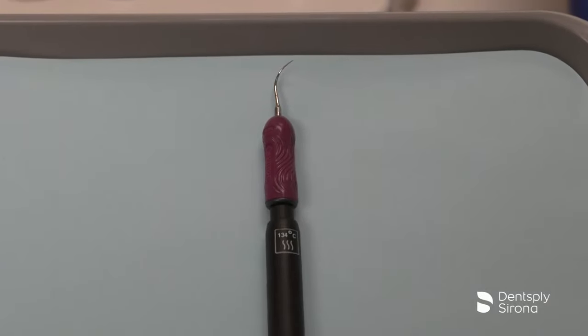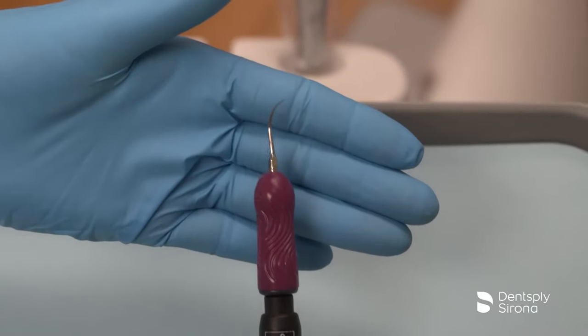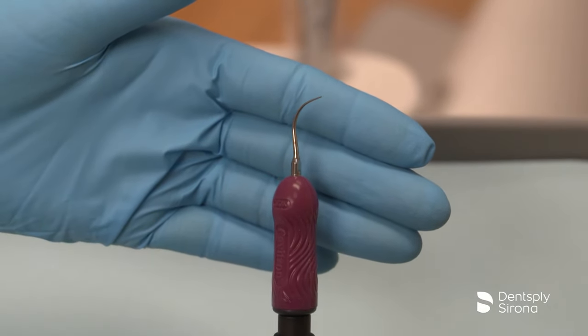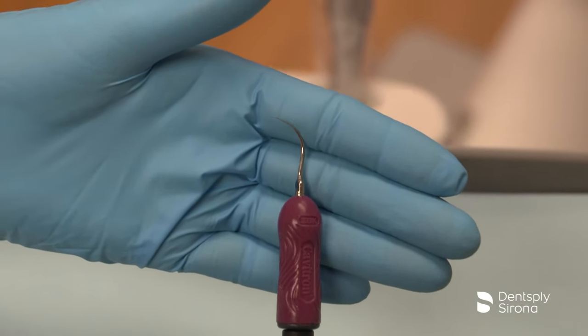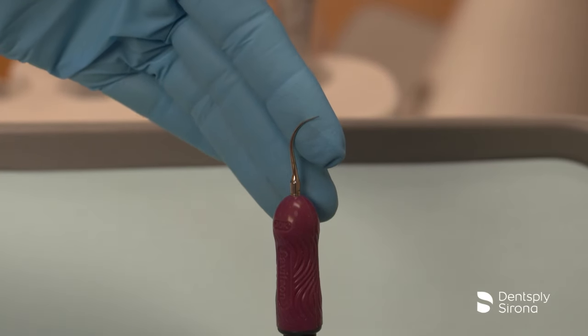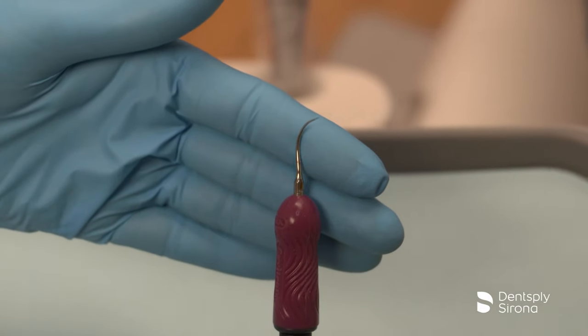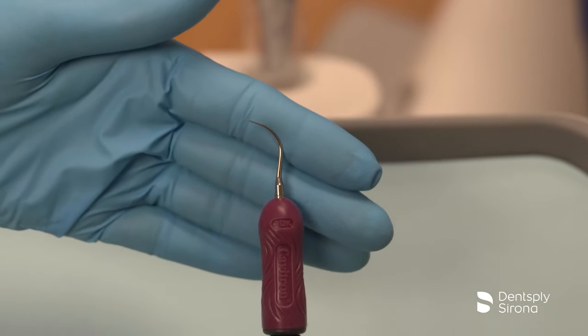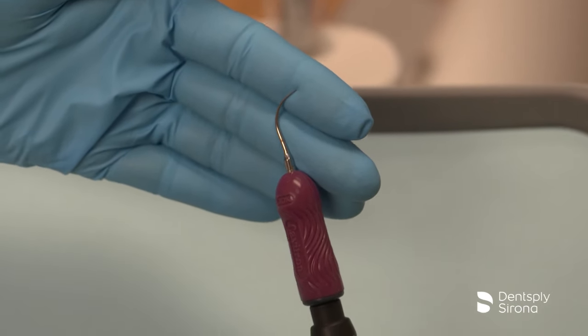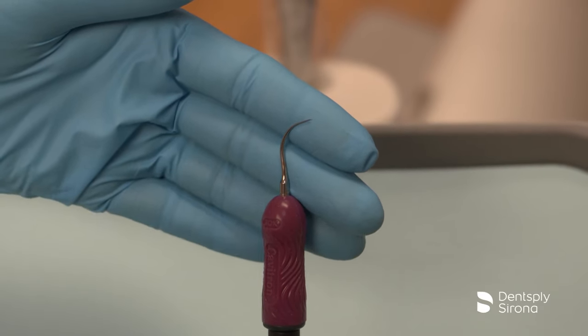This is the Cavitron FSI Thinsert. This insert is 47% thinner than the Cavitron FSI Slimline 10. It provides access in difficult areas including misalignments, interproximal surfaces, and areas of tight tissue. The Cavitron FSI Thinsert is ideal for completion of a staged instrumentation sequence to assess the areas for remaining deposit while performing thorough biofilm disruption.